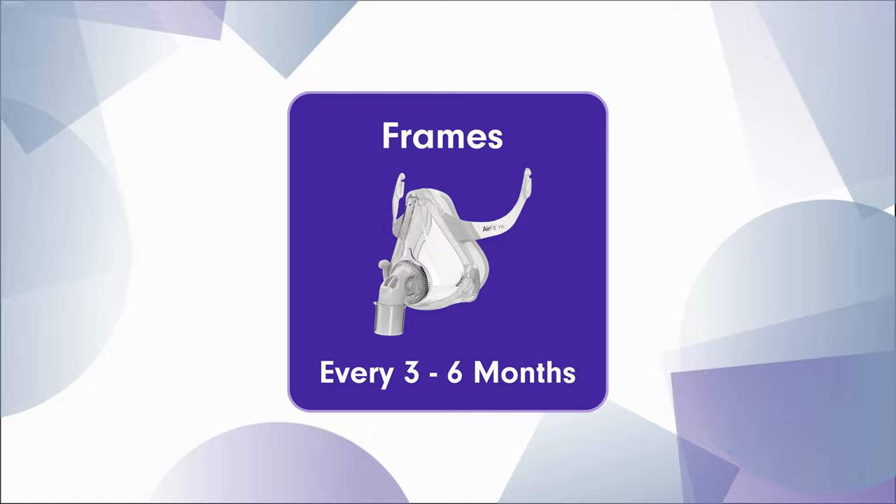If your CPAP headgear is still new, look into mask frames — this is essentially the CPAP mask just without the headgear. As a heads up, mask frames can be up there in price, so for some of you it may make more sense to change the whole entire mask instead of just the mask frame.